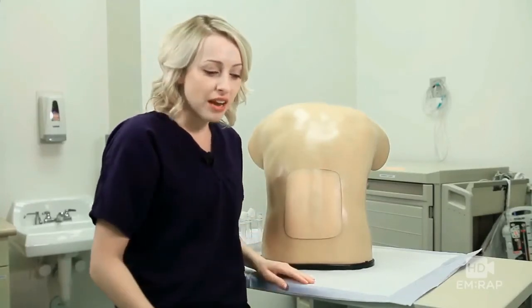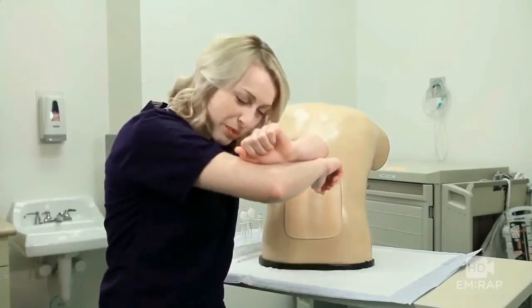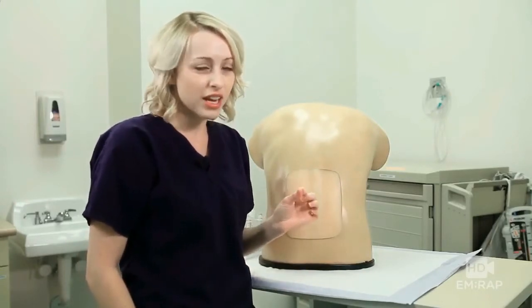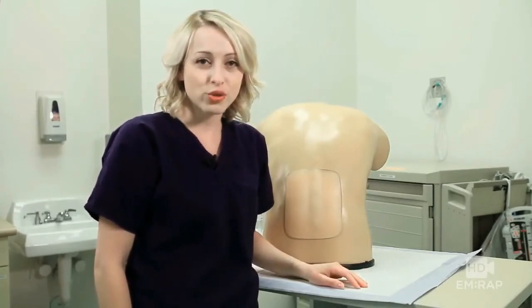If they're sitting up, you can have them rest their feet on a stool and then rest their head and arms, maybe on a table in front of them. You can also consider giving them a little bit of benzodiazepine to help them through the procedure. Let's take a look at the real procedure done by Dr. Jordan Harp.